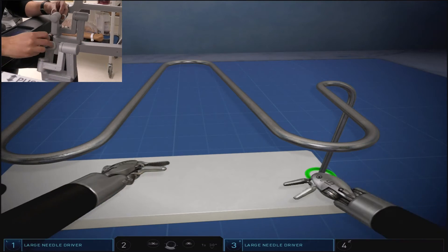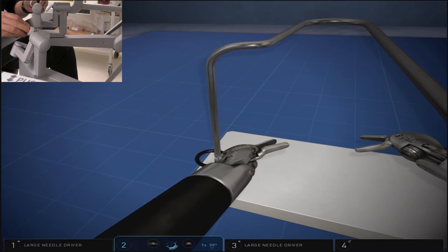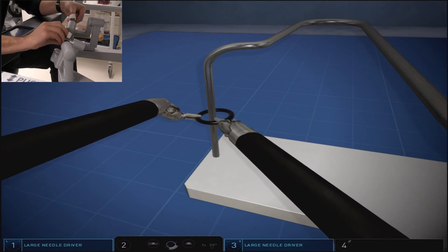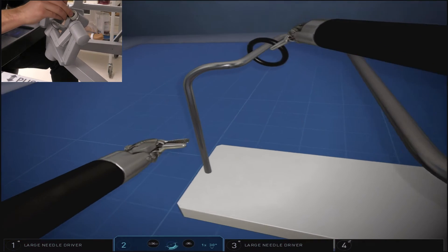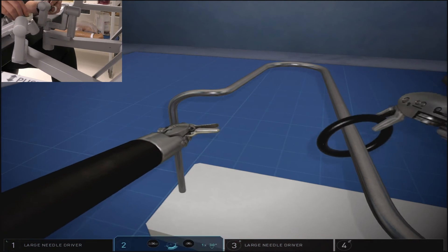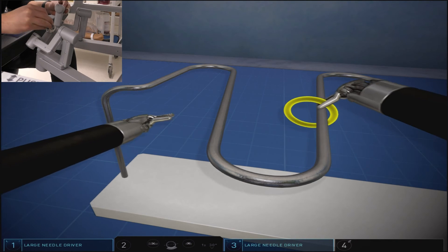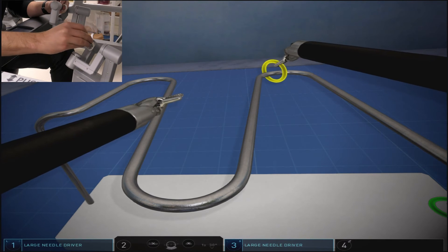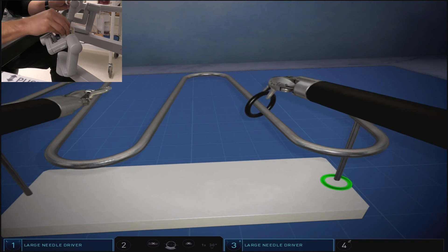As we move on to the second ring, we want to draw attention to the hand view in the upper left screen. Again, we grab the ring on the anterior portion with the hand in the pronated position. Notice that the right hand is grabbing the da Vinci hand controls with just the tips of the fingers, which allows for improved range of motion as we switch from pronation to supination around the curves.